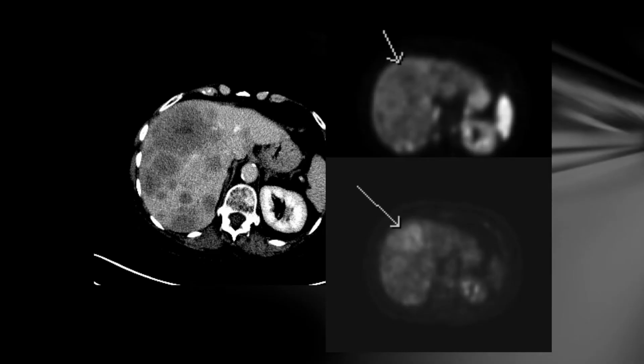In fact, many of those lesions demonstrated increased uptake on another kind of PET-CT called an FDG PET-CT. That's basically, instead of targeting receptors on cell surfaces, a sugar scan. So we radiolabel a sugar molecule, and sugar molecules are taken up by cells which are turning over rapidly.